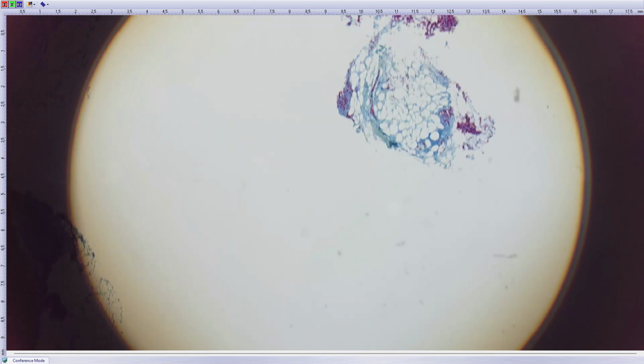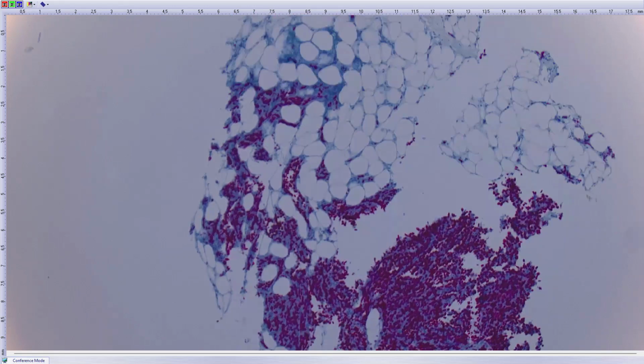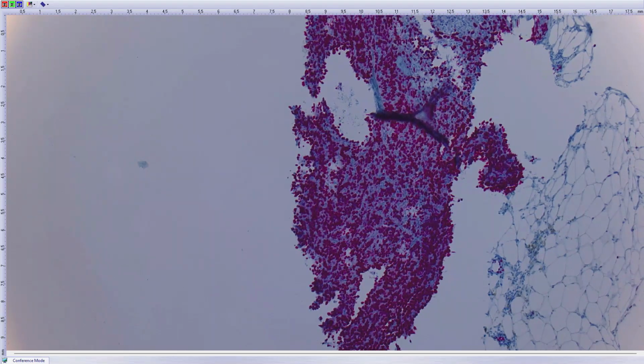This lady had already been diagnosed with angiosarcoma, and this is a recurrent tumor. So this is ERG protein staining. Yeah. So angiosarcoma of the breast in an old lady in a core biopsy. So was she irradiated because of something else, or? Probably yes, because this is, as always, not given. The full medical history is not given, but at least they were kind enough to say that there is angiosarcoma in their medical history.